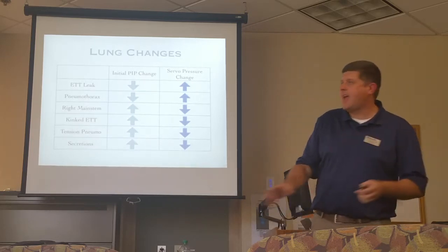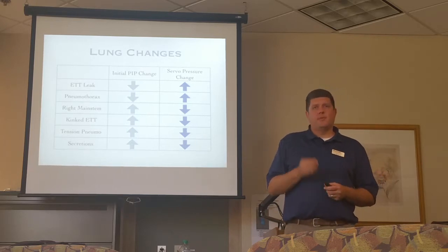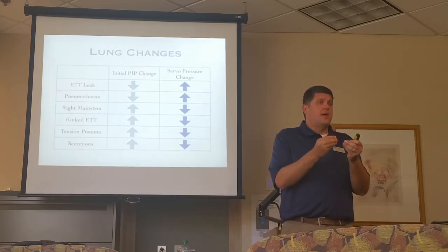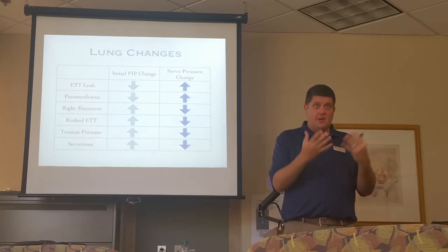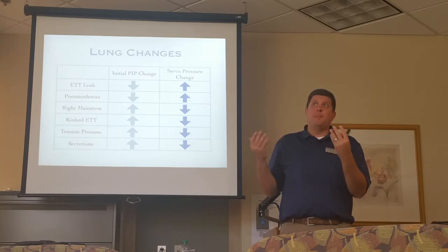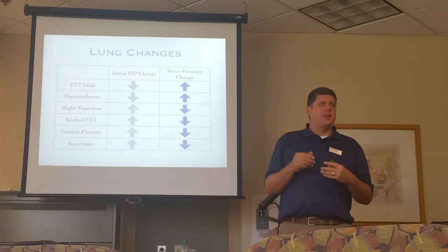You know, day to day, I look at suctioning about whether my patient needs to be suctioned or not. The servo pressure can help tell you that. This is why it's important for you guys to know with your baby what his baseline servo pressure is. Okay. Know that, hey, at a servo of 2.4, you have good chest wiggle, CO2's good, that's our happy place, okay? And so that when there's decompensation and you come in and the servo pressure is only 1.8 instead of 2.4, you know it's supposed to be 2.4. That's why you don't have chest wiggle. That's why we're starting to decompensate.